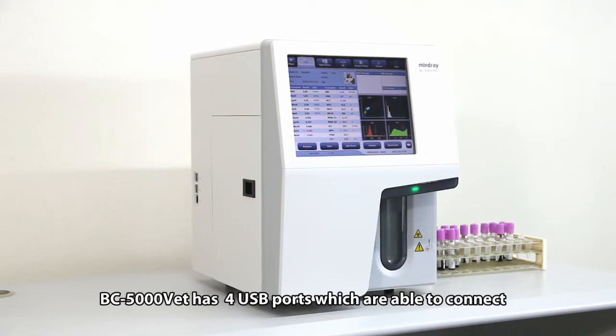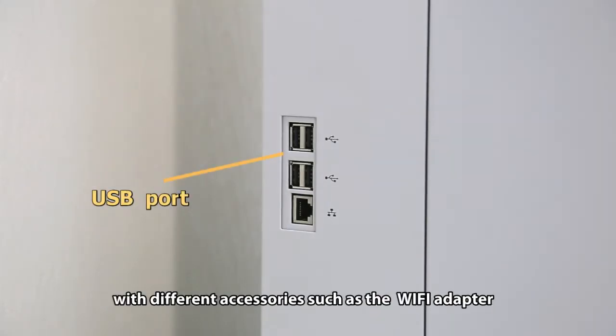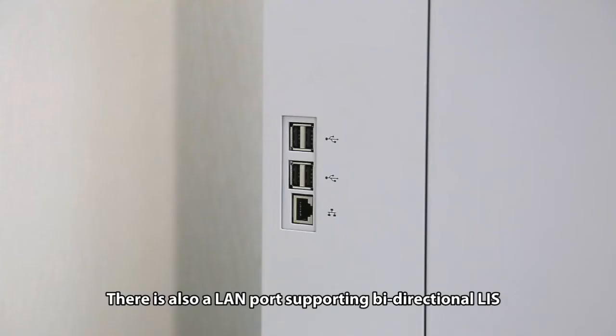BC 5000 VET has four USB ports which are able to connect with different accessories, such as the Wi-Fi adapter, printer, keyboard, mouse, barcode reader, and more. There is also a LAN port supporting bi-directional LIS.